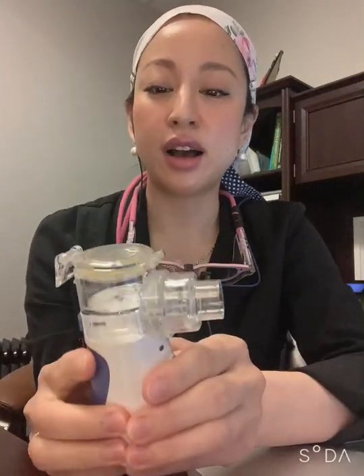So, that I'm not quite too sure. I think that I had addressed an issue of leakage around the mask by making sure that you keep a good seal of the mask around your face. So hopefully that helps. Otherwise, this is a short video.